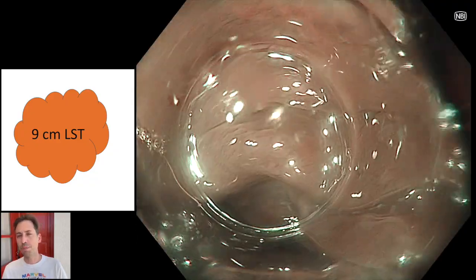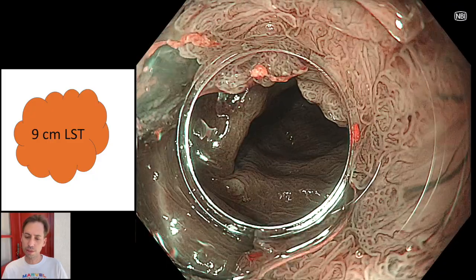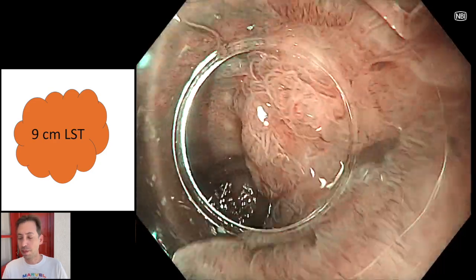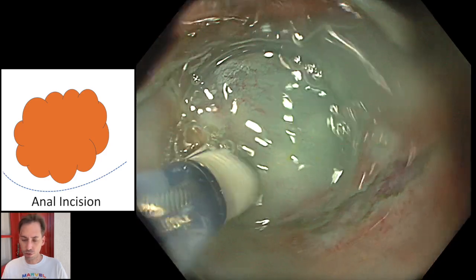The patient has been positioned in such a way that gravity is pulled against the lesion, so in this case at the left side. The first step is to create an anal incision.